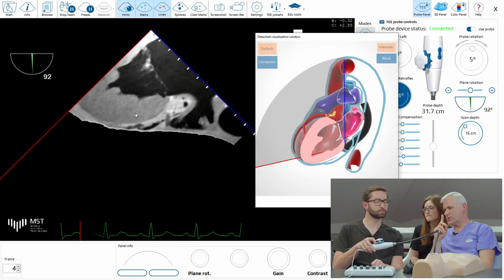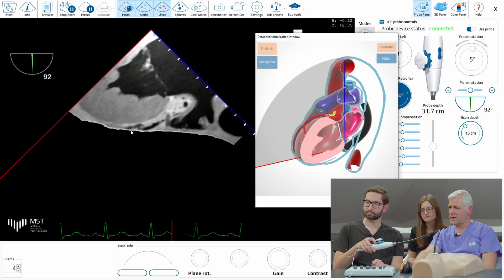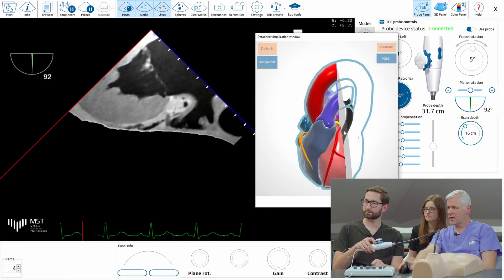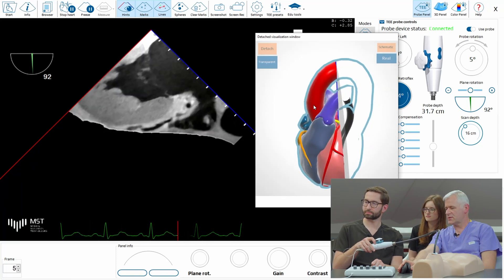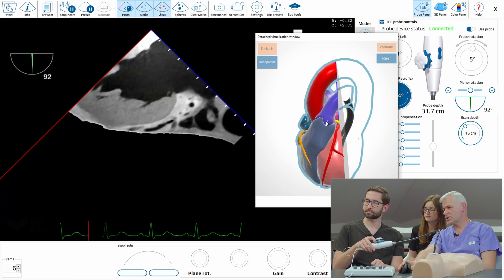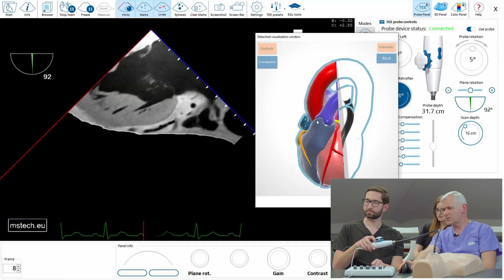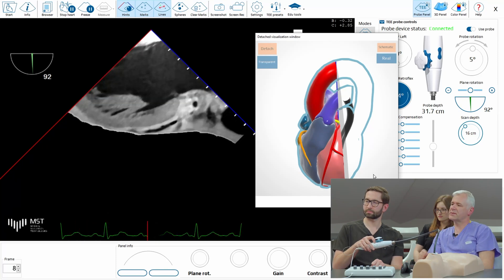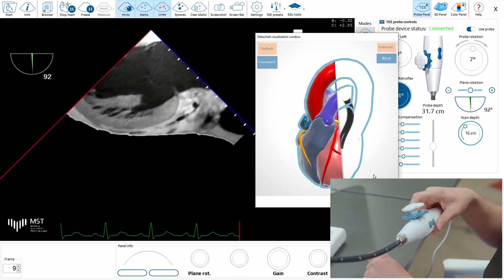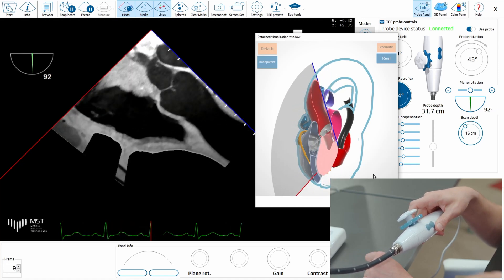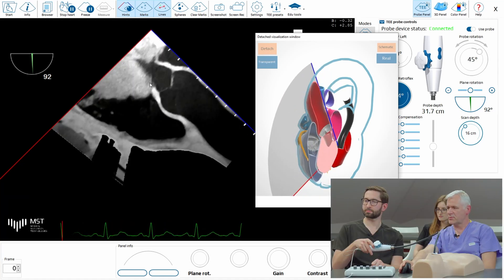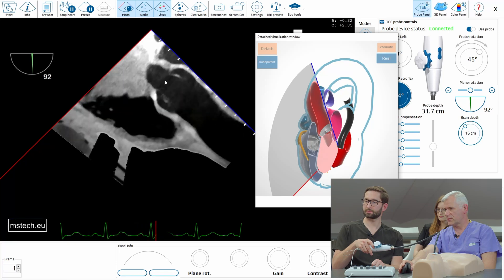First, one very important view, which you can have very easily, is the view in which you can observe the ascending aorta and the aortic valve and LVOT. So where would you go from here to see the aortic valve? Would you rotate left or right? Right. Correct. So go right. Stop. And look what you have on the image — a beautiful view of the ascending aorta with the aortic valve.